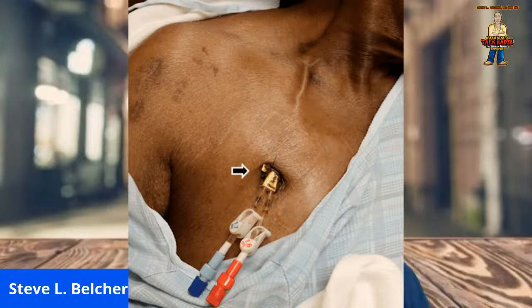So if we look at this guy's catheter, we see it looks clean. You don't see any drainage. The only thing is, when you've had these types of catheters over a period of time and you put tape or some type of adhesive dressing on it, that adhesive can stick to that catheter plastic piece where that arrow is pointing.